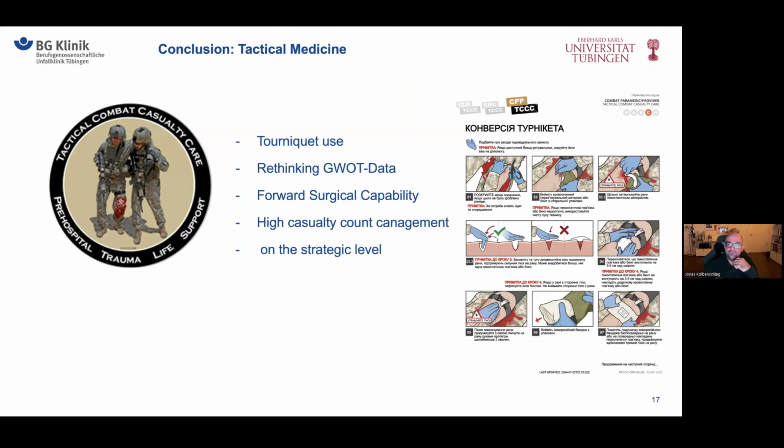And for the femur implants, I think there's a technique that Alexander Rickard and we came up with, is that you can go through the greater trochanter and perforate. You cannot do that in the shoulder, obviously, because then you're in the joint, but you can do that in the femur, so you can elongate and have a secondary cortical contact point. So you can kind of play around those limits. But the femurs you show in Alexander's and my presentations are already very, very short.